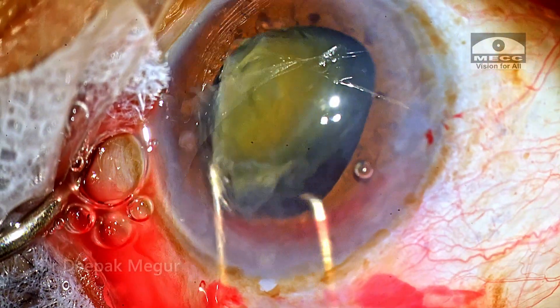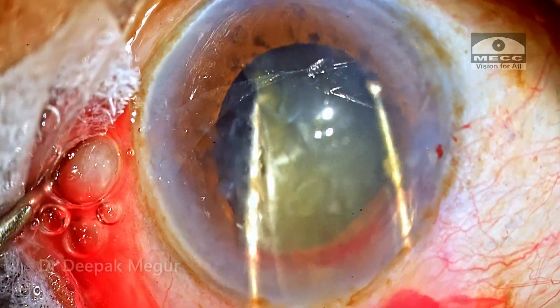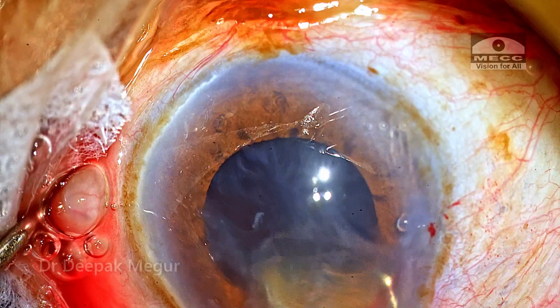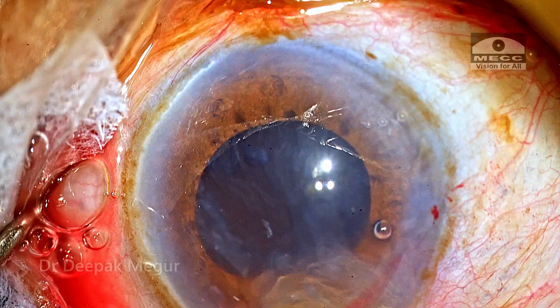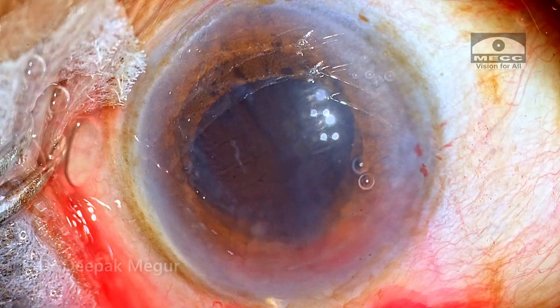Under cover of OVD, using a vectis and a dialer, it is easily extracted out using the phaco sandwich technique. The second hemi nucleus is then prolapsed out of the bag and then using the same two Sinski hooks it is easily extracted out of the eye.